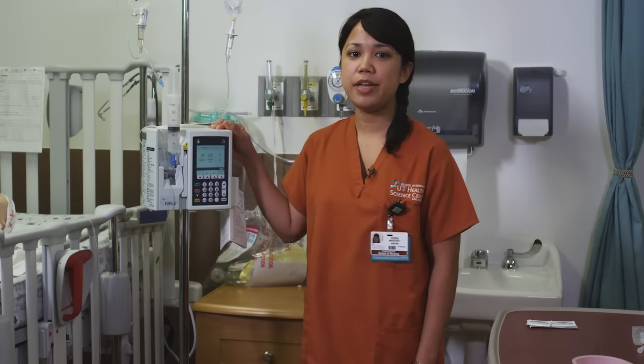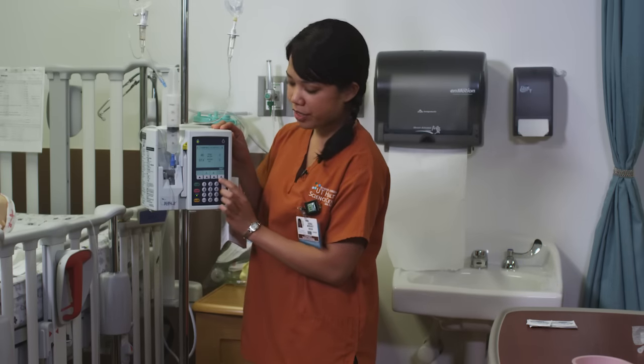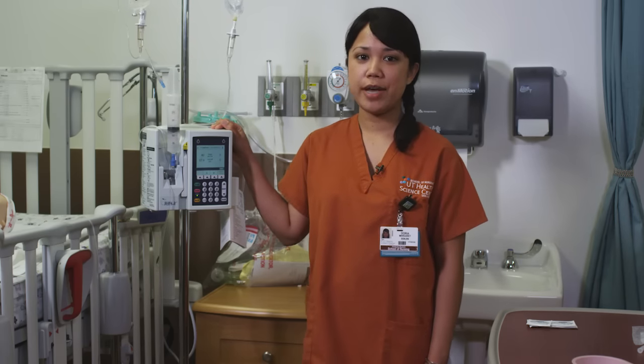Common alarms that you may hear include air, occlusion alarms, or high pressure. First, push your silence button, read the screen, and if you're unsure, just call your instructor or your RN. Thank you for your time. I hope this video has been helpful.